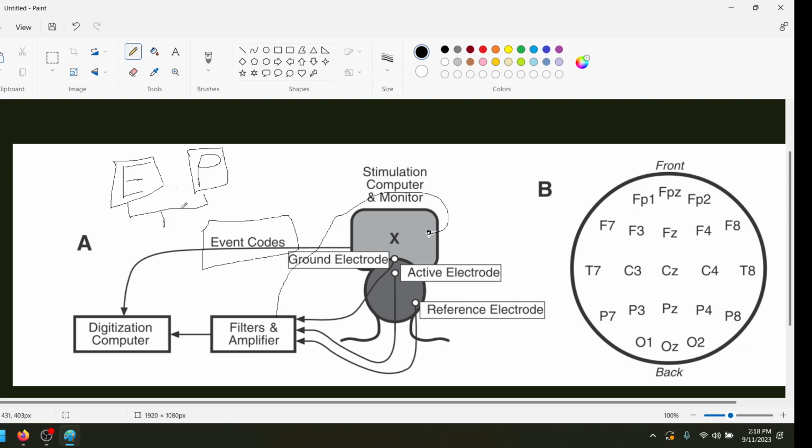So all you have to do is measure. You don't have to have a subject there. You just take this computer, plug in a photosensor, connect it to the amplifier, have it flash a screen and send a signal like 1,000 times, measure what that average delay is, and then just delete that number of samples from the start of your EEG recording. So it's really that easy.